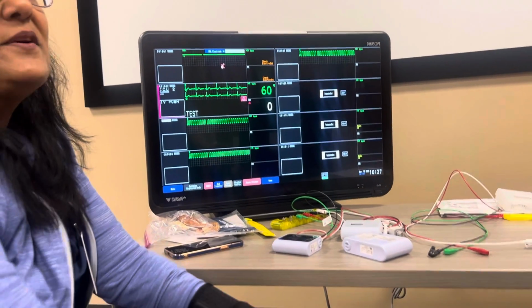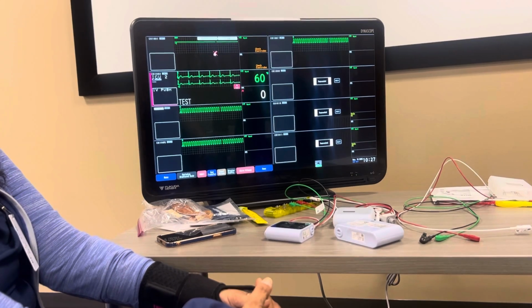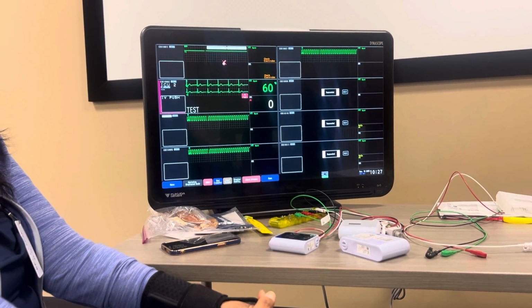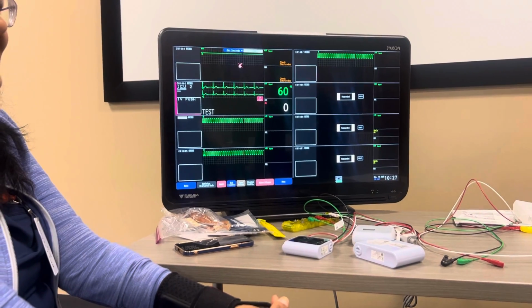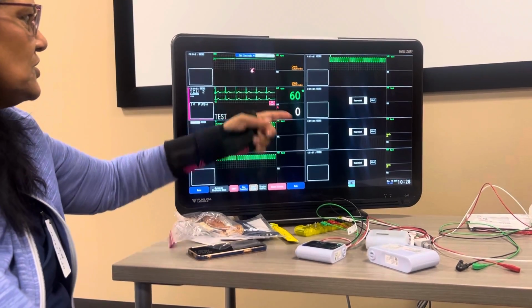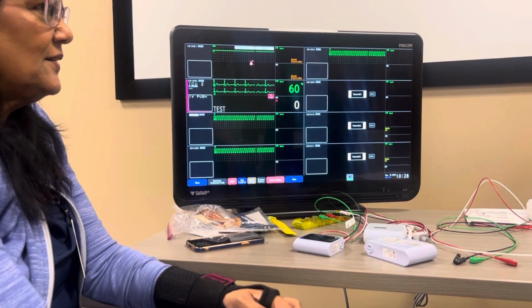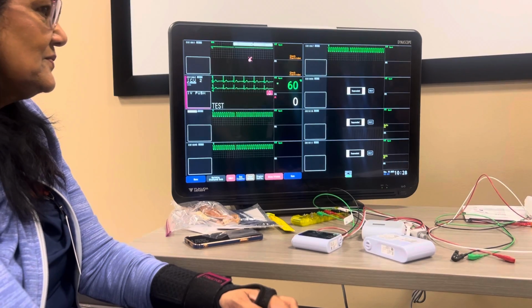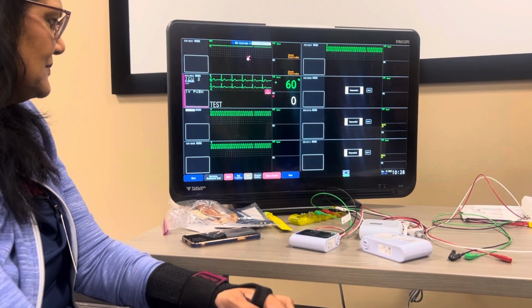Okay, so now I want to see all the VTAC that this patient has had since they've been here. How do I look that up? You want to see a specific patient, this patient. Okay, I think I know this one. Sorry. You're okay. Optimized displayed beds.